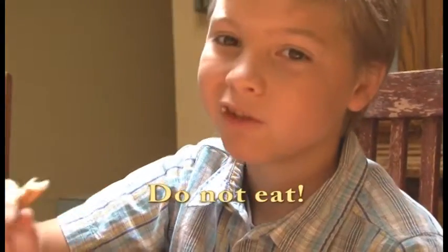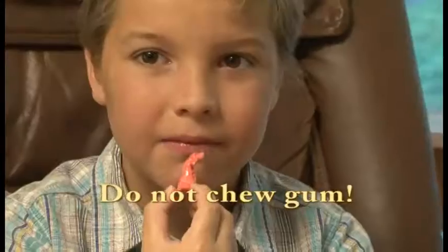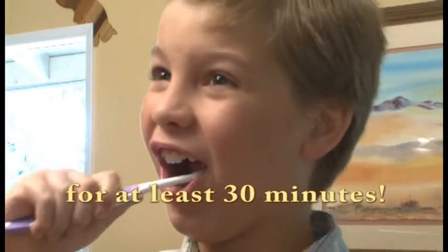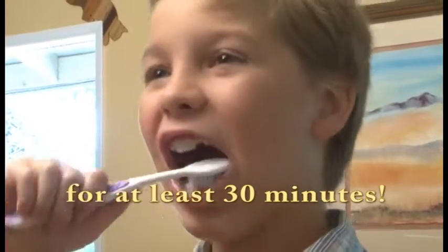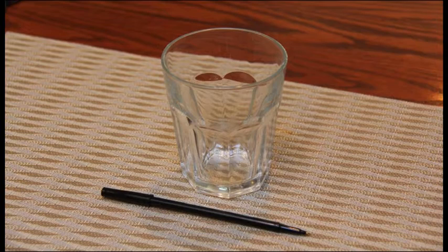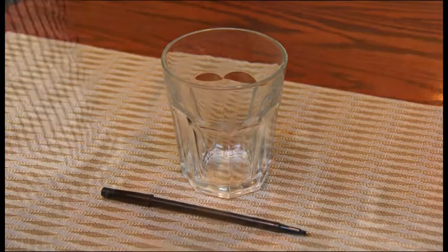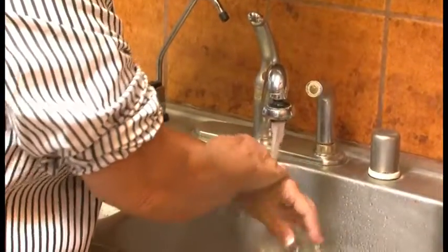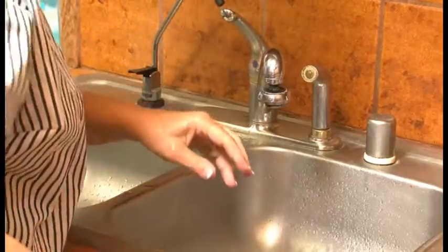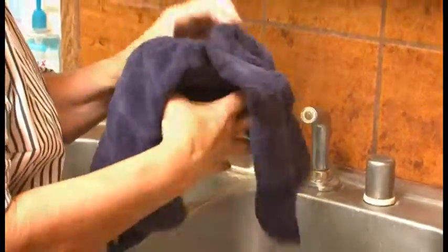Okay, let's get started. First of all, your child should not eat, drink, chew gum, or brush their teeth for at least 30 minutes before collecting the cells. Before you continue, you'll need a pen and a clean drinking glass. You'll use the glass after you've collected the buccal cells. Now, to further ensure against contamination, you should thoroughly wash and dry your hands.